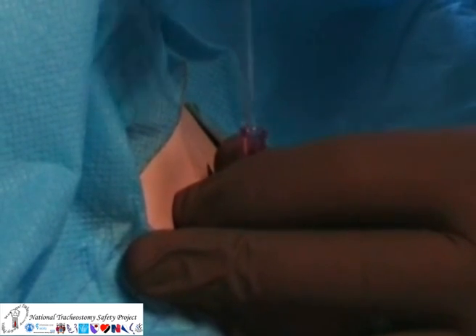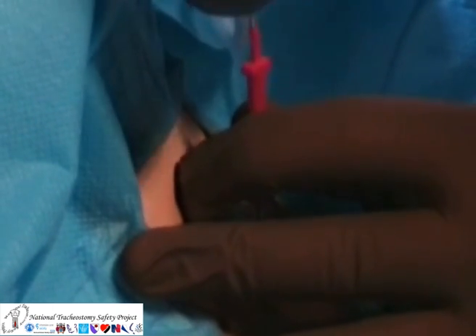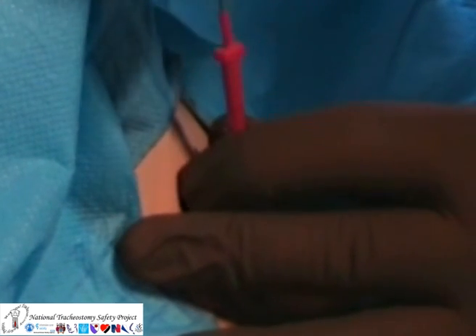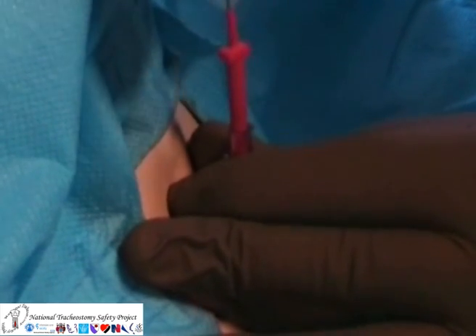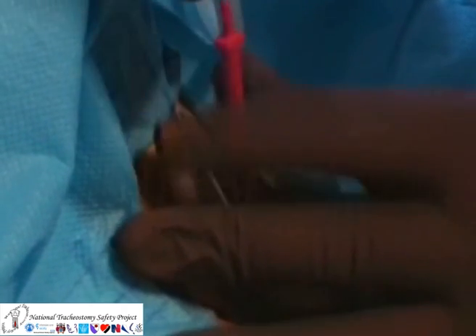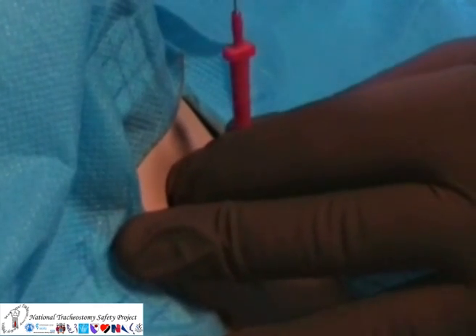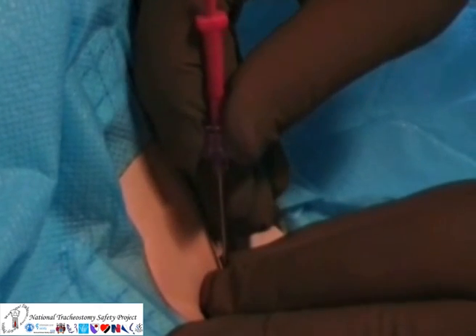A wire can then be inserted through the needle using the Seldinger technique. The needle and introducer are removed, leaving just the wire in situ.